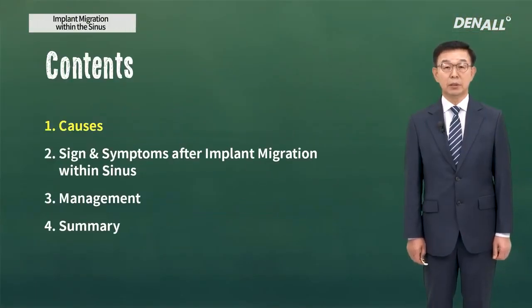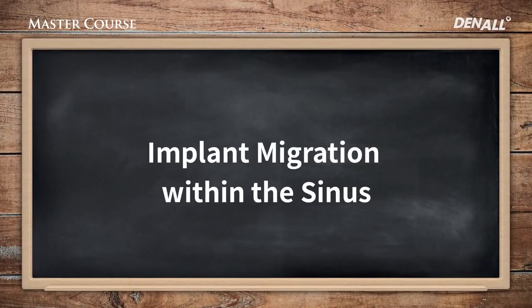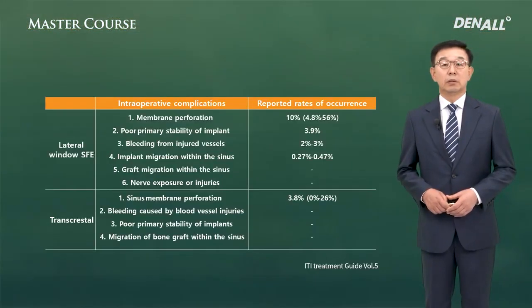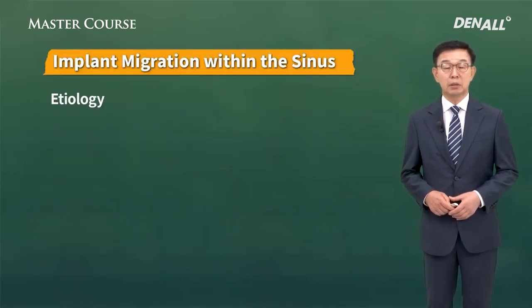Today, I'm going to look at the reason why the implant migrates into the sinus, the symptoms, and how to manage this problem. When you do a lateral approach, at times, the implant can migrate into the sinus. Let's look at the cause.